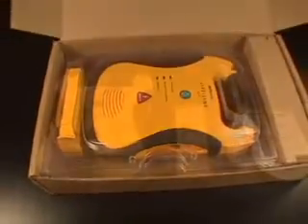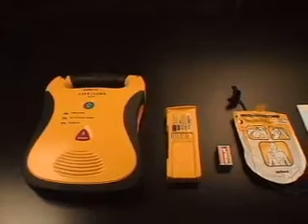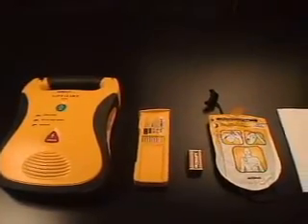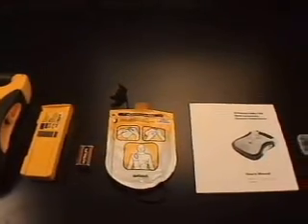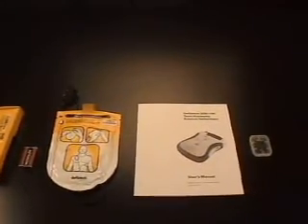The critical components of the Lifeline AED system are the Lifeline AED, a lithium battery pack, a 9-volt battery, a pad package, a user's manual, and optionally, a data card.